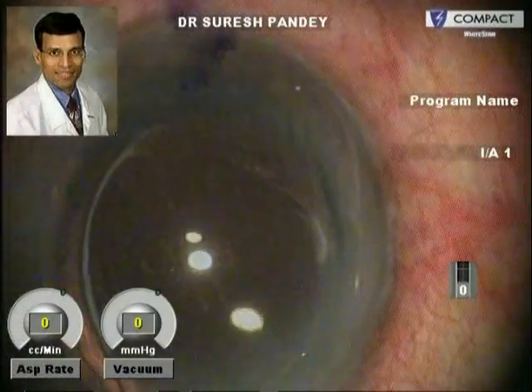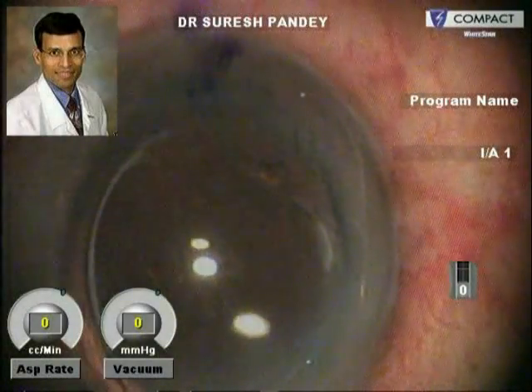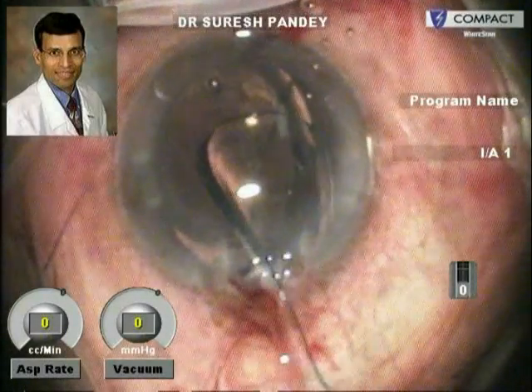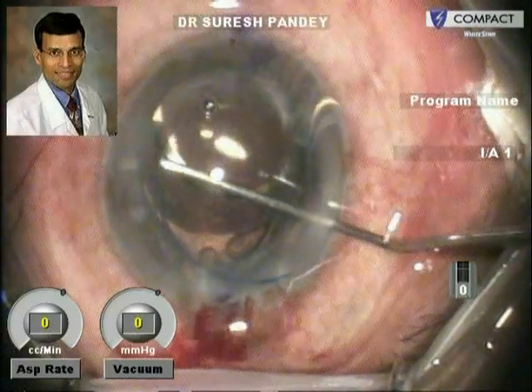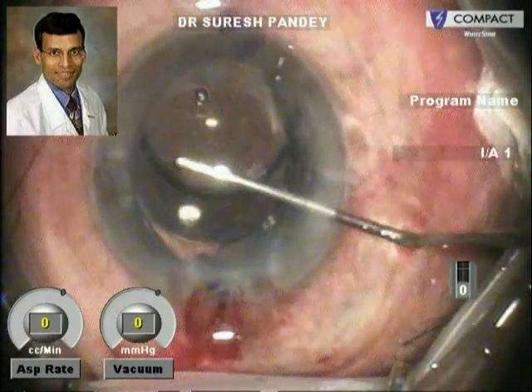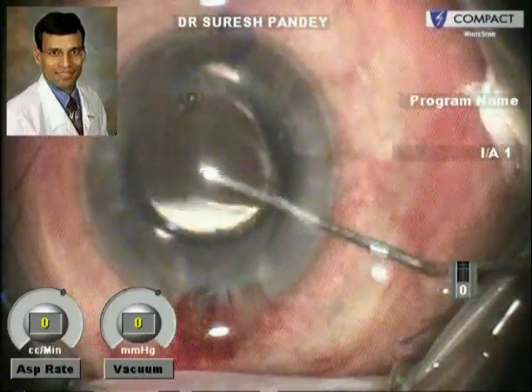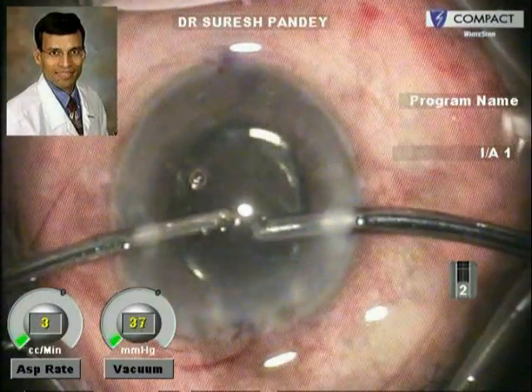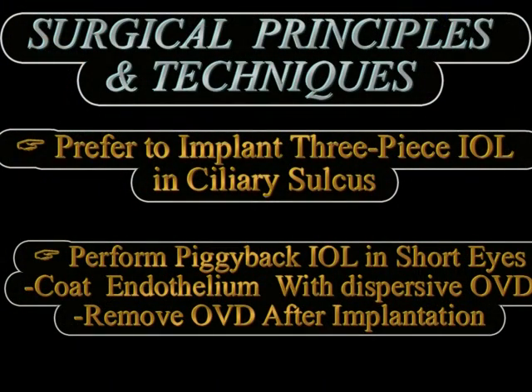Coming to the surgical technique, it is generally preferred to implant a three-piece IOL in the ciliary sulcus and we should never implant a square edge IOL, to minimize the chances of iris chafing. In cases of high hyperopia with short eyes when we do a primary piggyback IOL implantation, we must always protect the corneal endothelium, because these are relatively shorter eyes with shallow anterior chambers, and therefore coating the endothelium with a dispersive viscoelastic is extremely useful.